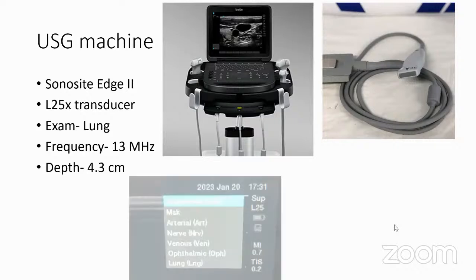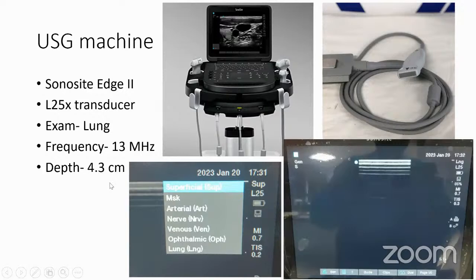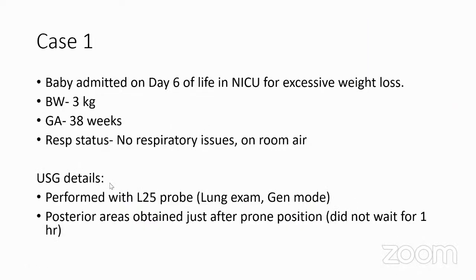I use the lung exam mode, which is available on the exam in the lowermost, bottommost panel. And I usually set the resolution to maximum so that I get the maximum frequency of 13 megahertz. And I usually adjust the depth to 4.3 centimeters. So this brings me to my first case.